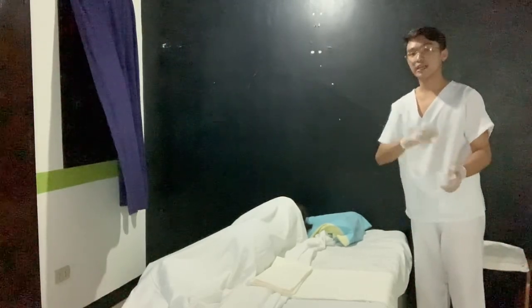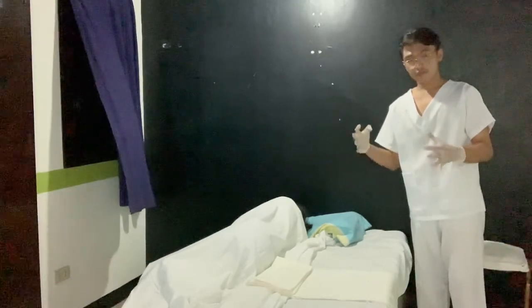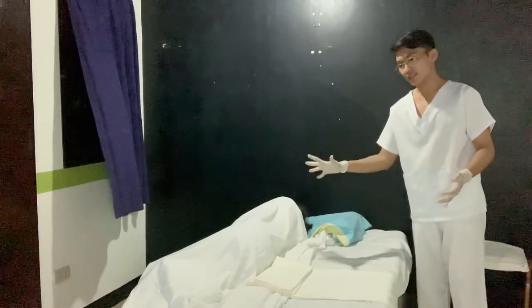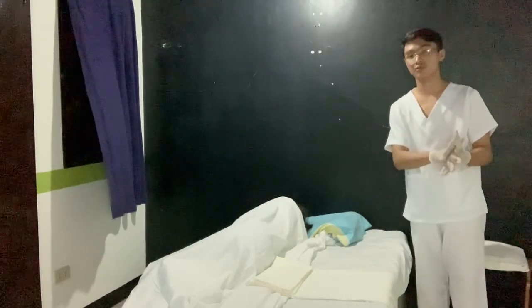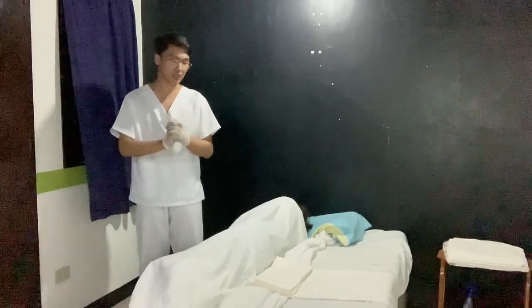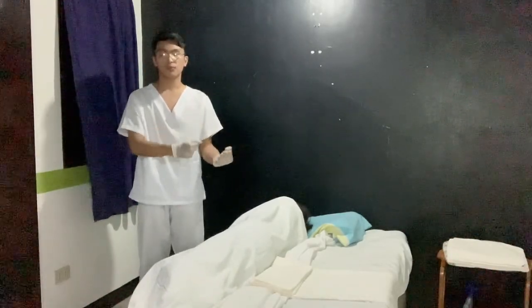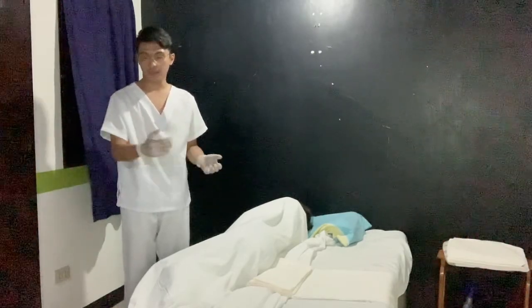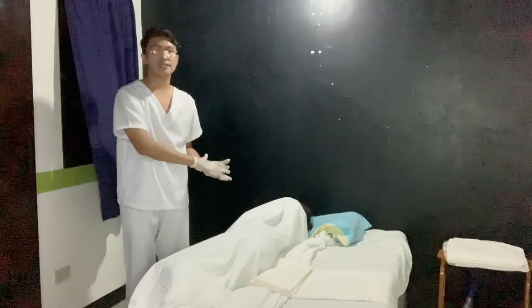We're now going to the other side to untuck the soiled bottom linens and dispose of them in the hamper. So now, before we start to pull over the bottom linens and the draw sheet on the other side of the bed, and change or remove the soiled bottom linens, we need to position the patient again.